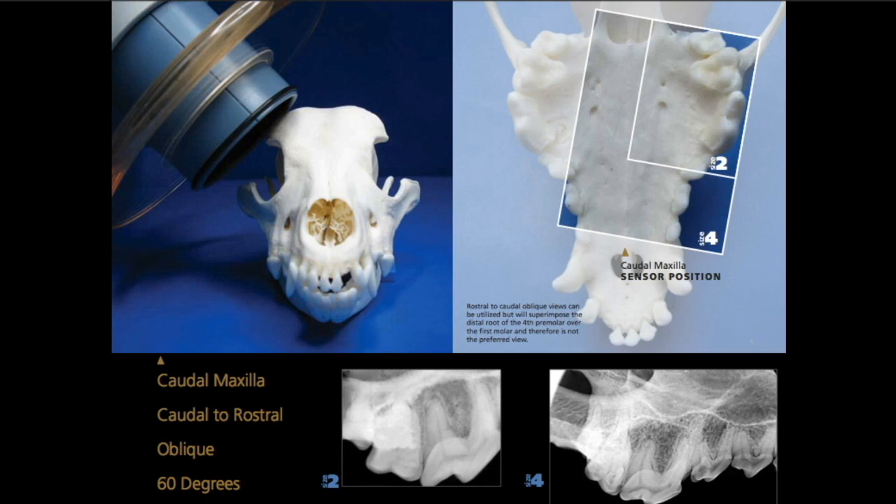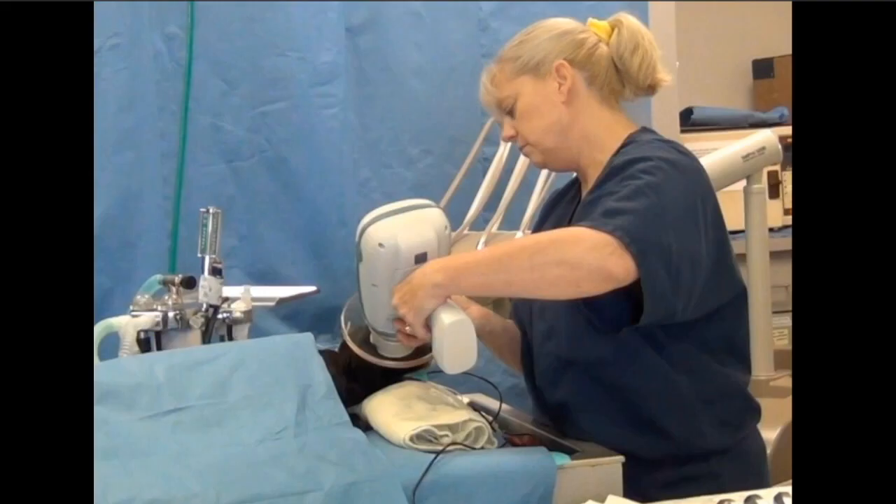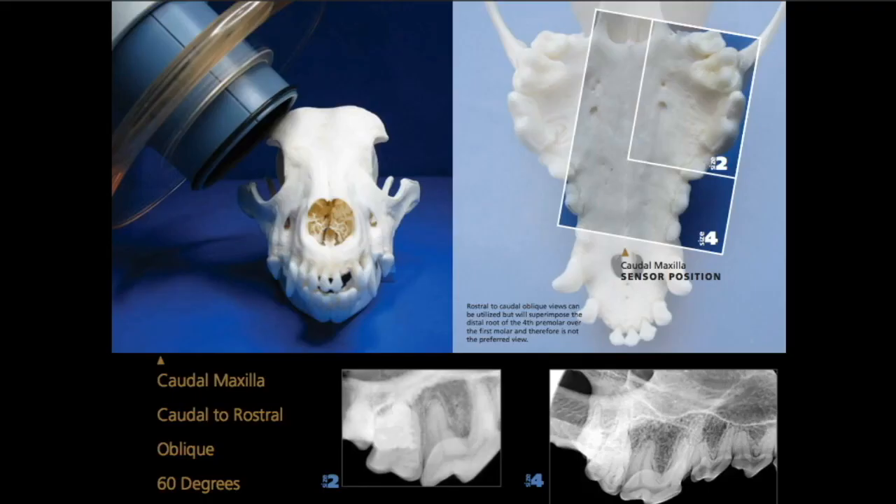Let's go through quickly and show you how to use this. The first thing we're going to do is not only standardize the positioning, we're also going to standardize the sequence that we take these radiographs. We set up our template in our software so that it is numbered exactly as I'm going to take you through. We always, always, always start our full mouth series on the right maxilla, just like Annie is showing you right there. We're using a Nomad, which is a handheld, so Annie is using that 60-degree designation.